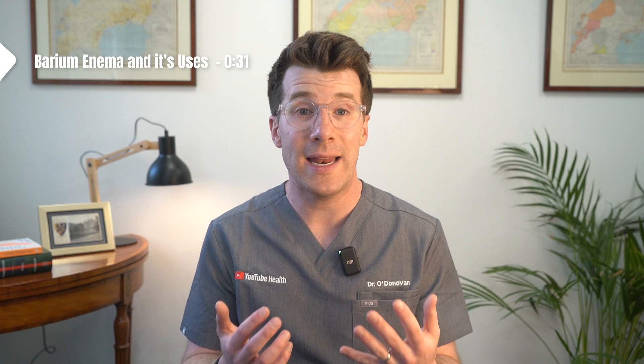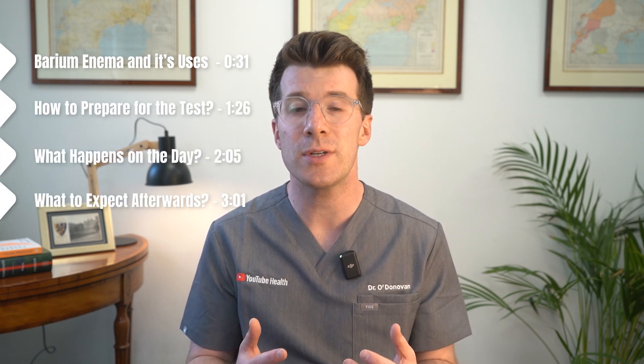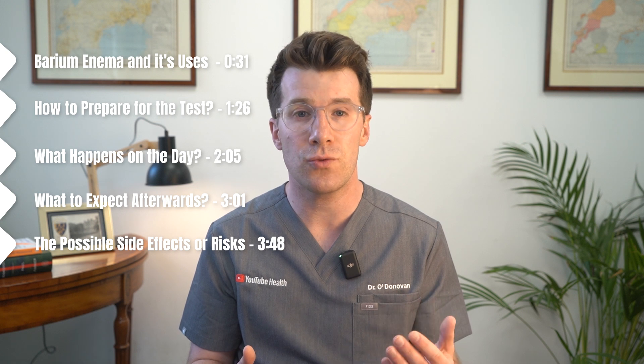In this video we'll cover what a barium enema is and when it's used, how to prepare for the test, what happens on the day, what to expect afterwards, and the possible side effects or risks.